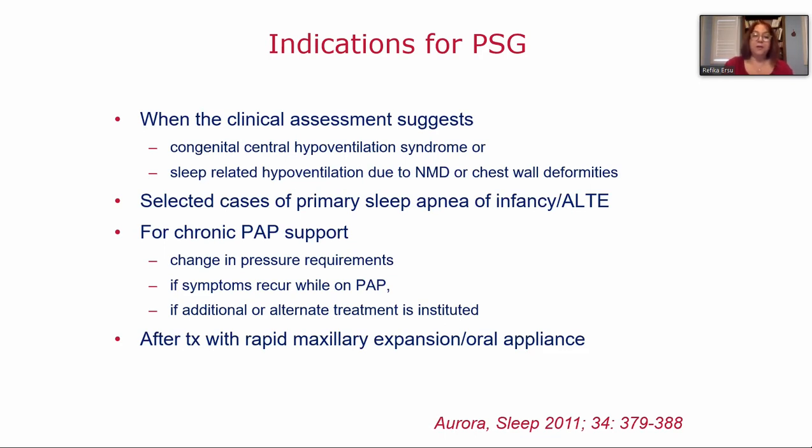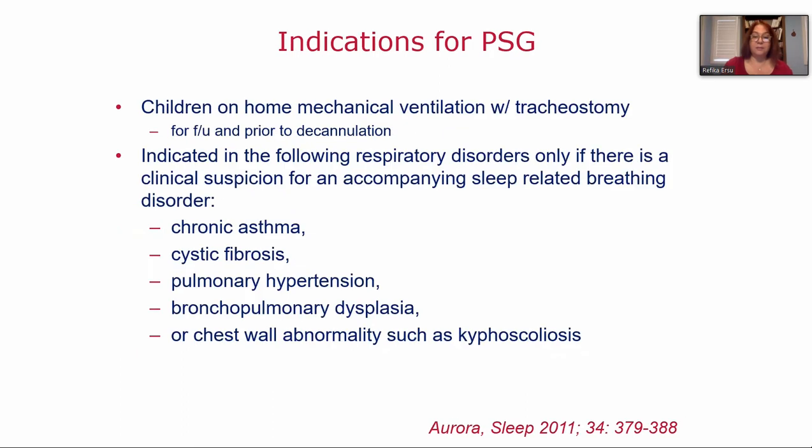And then for orthodontic treatment, after treatment with rapid maxillary expansion, it's good to know if the obstructive sleep apnea has resolved. It's recommended. Children on home mechanical ventilation with tracheostomy, for follow-up, this is again a question. Some centers just do a cardiorespiratory monitoring with recorded saturation and end-tidal or transcutaneous CO2, which is of course acceptable.